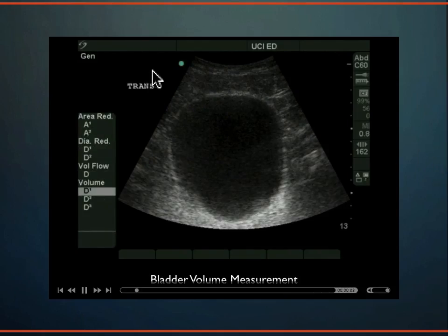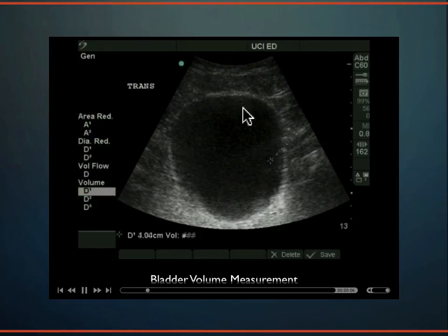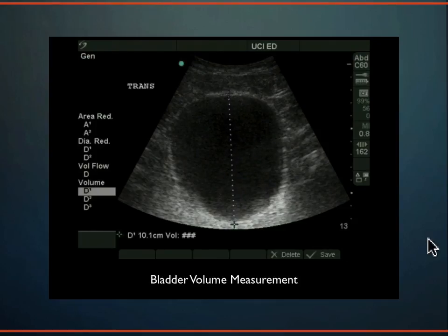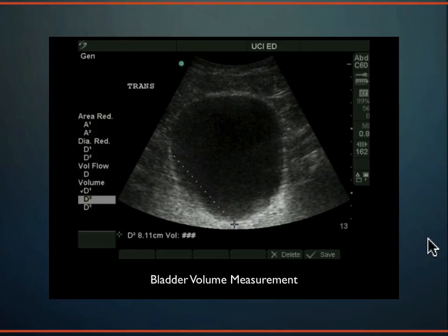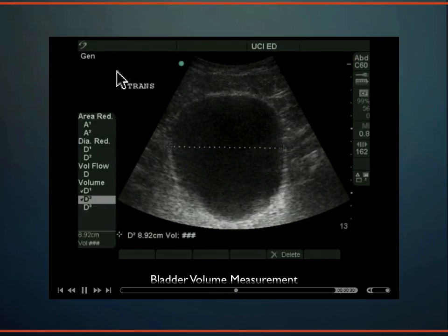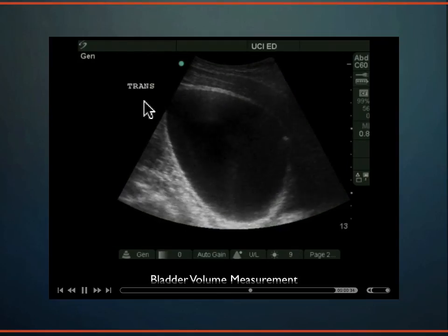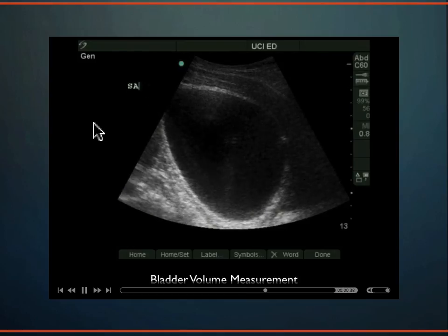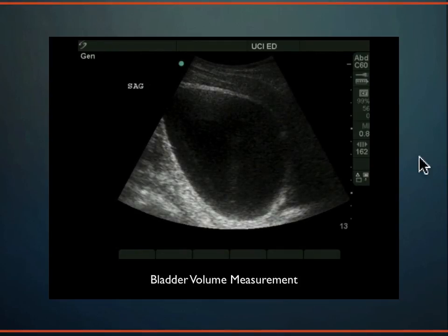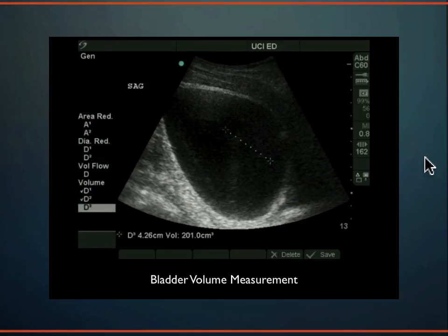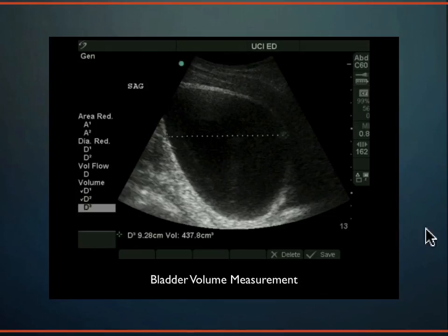Here is a bladder volume measurement example: in a transverse plane the bladder looks squared off and quite full. First measure the height, then the width. Then rotate 90 degrees to a sagittal plane and measure the length. Some machines allow you to lock in values so the software calculates volume automatically. In this example, the volume comes out to approximately 437 cc's of urine — a significant amount.